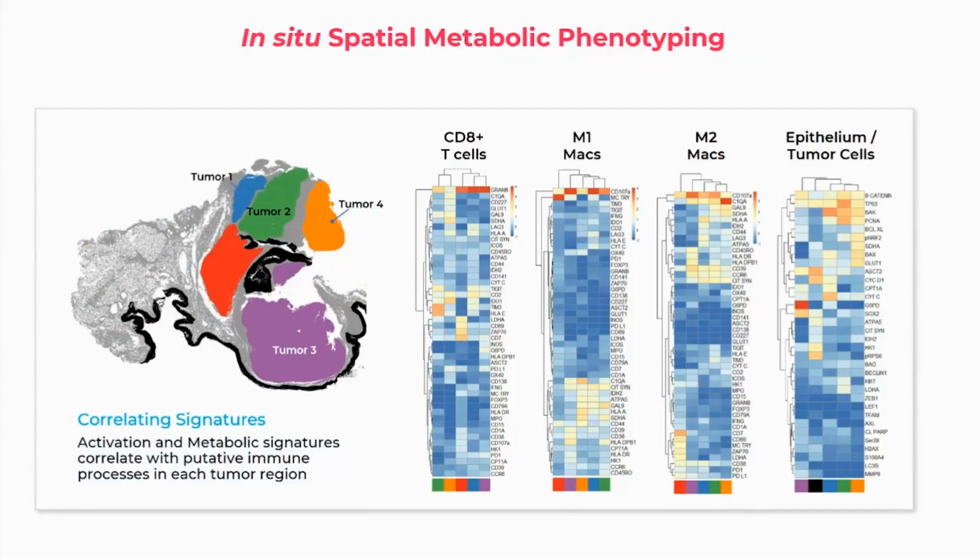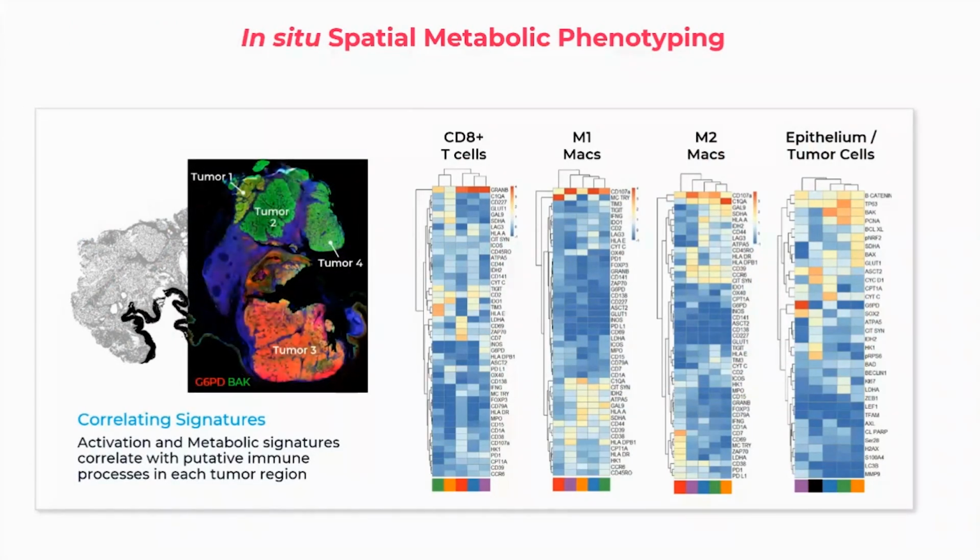What we could see was glucose 6-phosphate dehydrogenase was enriched in tumor region 3. That's the area that lacks TLSs. That's the area that has the M2 macrophage phenotype. It's a highly proliferative and hypoxic region. So that's your resistance to therapy. That's the area that will likely lead to the resistant phenotype in this patient.